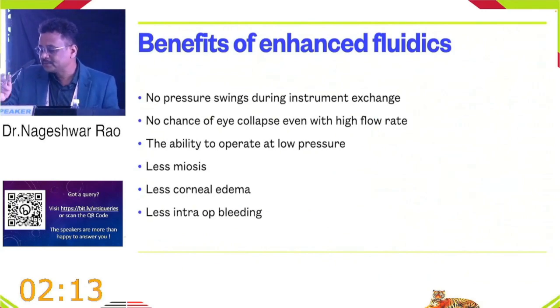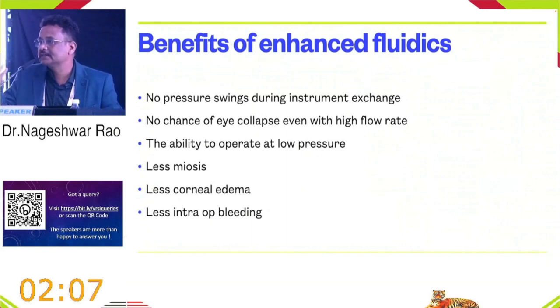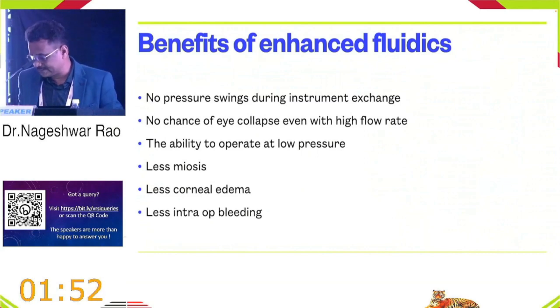And in fact, the benefit of enhanced fluidics is there is no pressure swing during instrument exchange, which reduces the chance of tissue incarceration, retinal incarceration, and no chance of eye collapse, and the ability to operate at low pressure, this is a major advantage. And the eye usually doesn't get miotic, corneal edema is lessened, intraocular bleeding is also lessened.